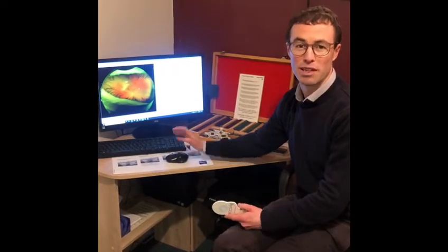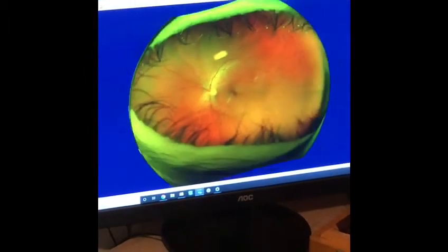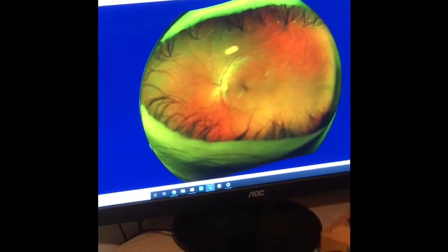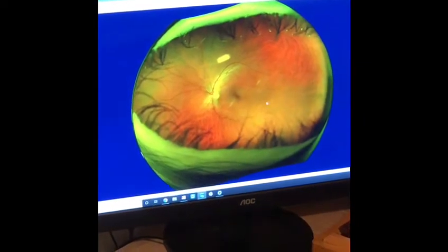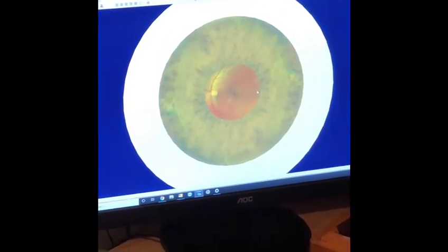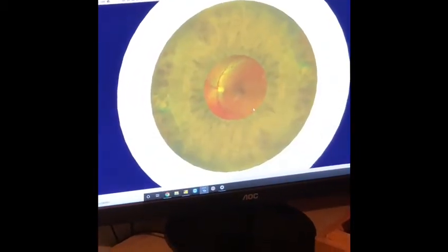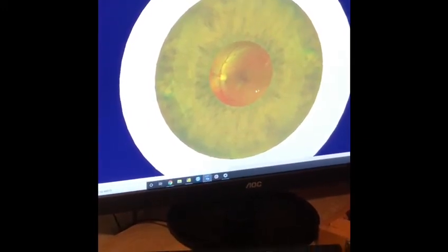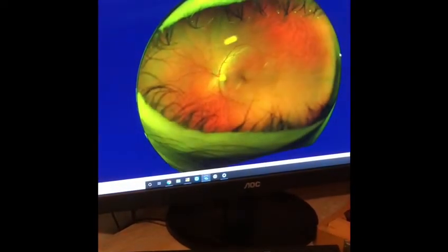I'll give you a brief explanation on screen here of what the Optomap shows us. So, in a nutshell, this is a scan, a 3D view of the back of my left eye, which we've just taken. My lashes are actually getting in the way, bottom and top, but it pretty much shows the whole of the inside of the eye. Whereas with a normal sight test, with a normal photograph of the back of the eye looking through the pupil, that's roughly how much a standard picture would show us. And we'd probably struggle to see a lot more than that in a normal sight test looking through your pupil as well. Whereas as you can see with the Optomap, we see an awful lot more.